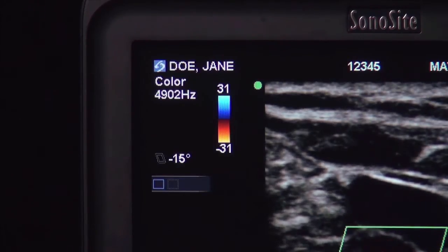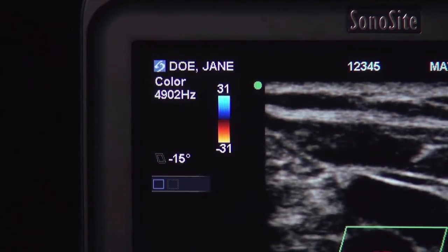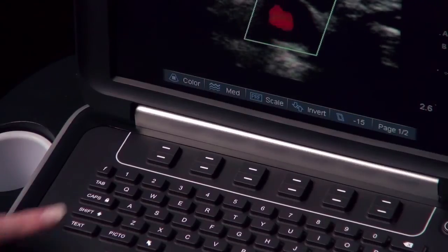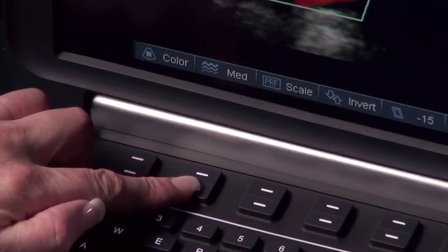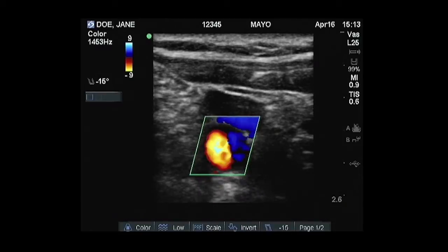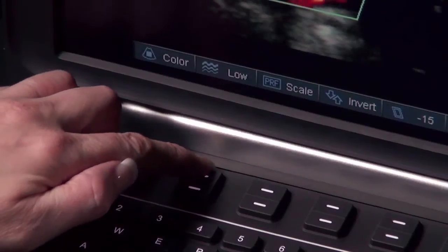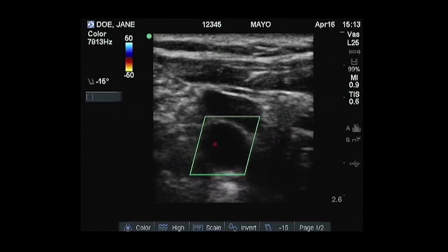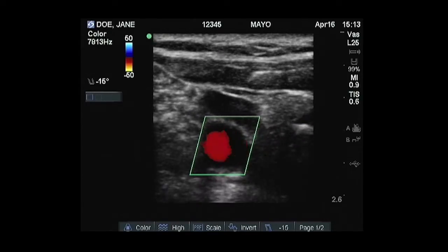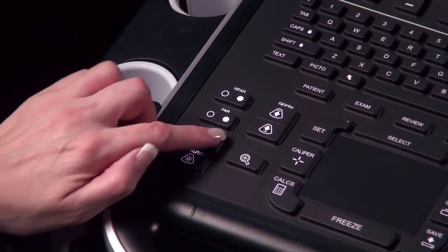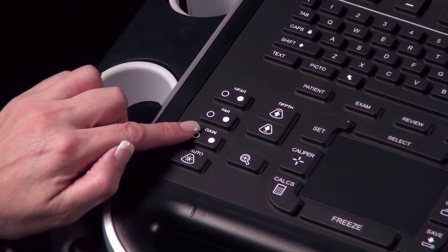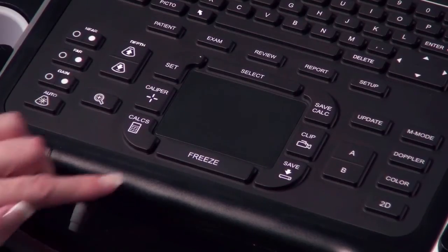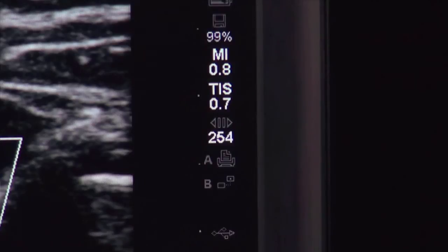The settings for color will be displayed in the top left corner of the screen. Select the desired sensitivity from the on-screen context menu. Low optimizes the system for low flow states, MED optimizes for medium flow states, and High optimizes for high flow states. Use the Gain key to adjust the overall color gain level for color power Doppler or color Doppler.